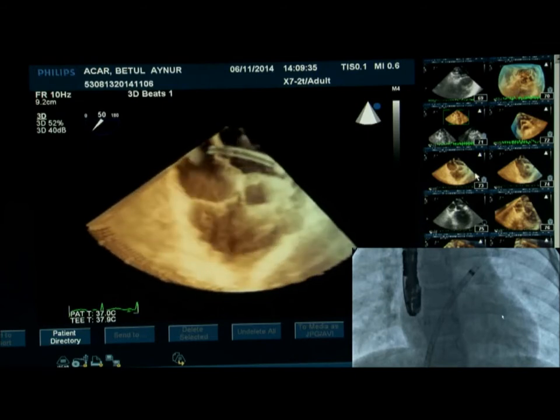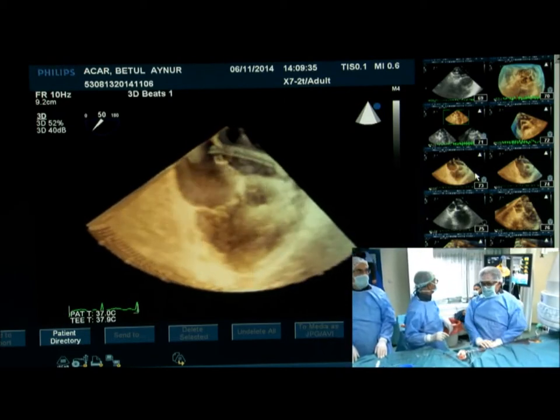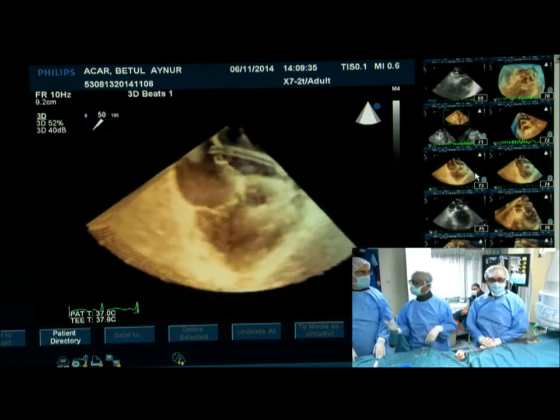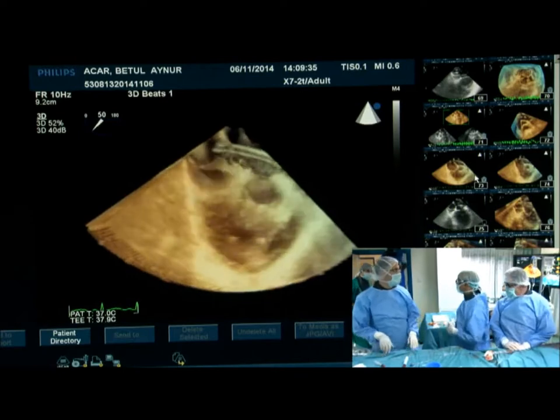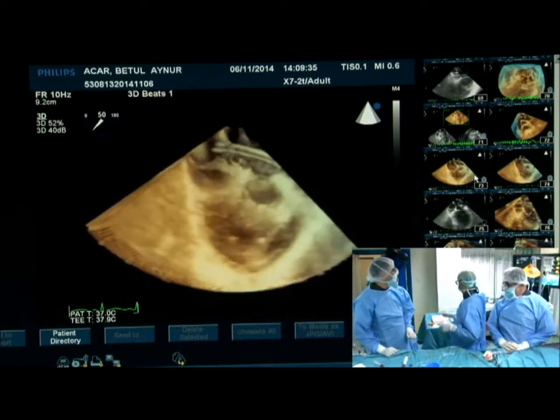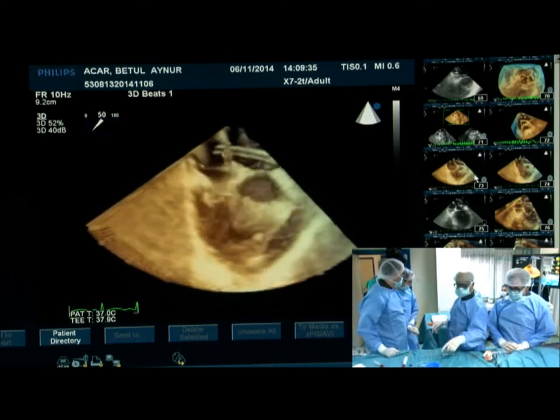So with me here, I don't know if you can see us, there's myself, not surprisingly, and then Dr. Nazmi is the first operator. Can you show Dr. Nazmi? They don't need to see me. Okay, there you go. And Shakeel on my right. Okay, so now we need a device, I think. 18, and a bowl of saline.